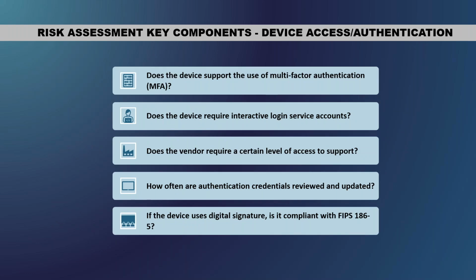Okay, so MFA. I'm going to talk about a little bit of this. I'm going to go a little deeper into the subjects for MFA because this is a big topic moving forward. But so, device access and authentication. Obviously, the ideal solution for any authentication is MFA, which is multi-factor authentication. However, how many of you have bought medical pieces of equipment and the vendor says that the access is Biomed123 or something like that?